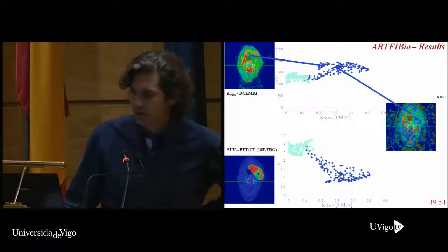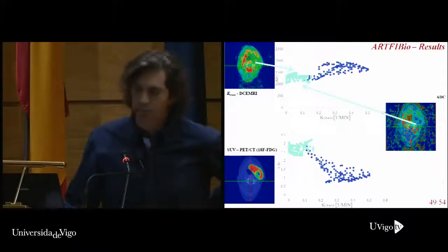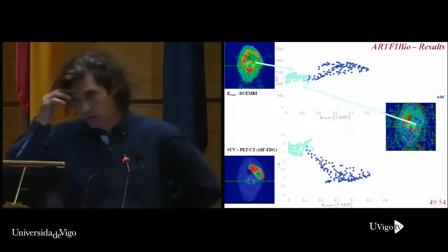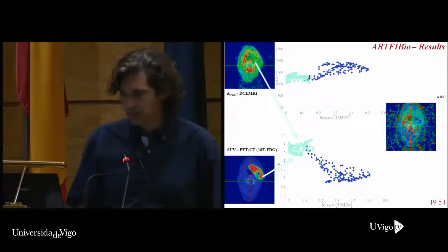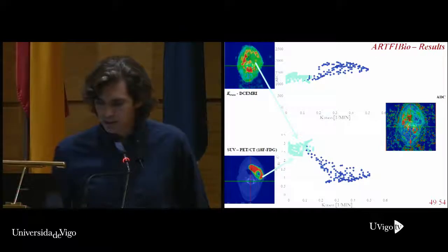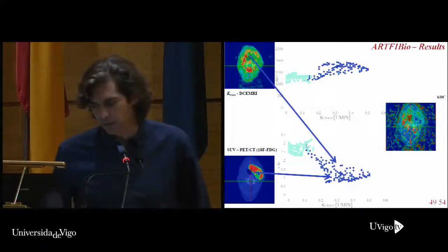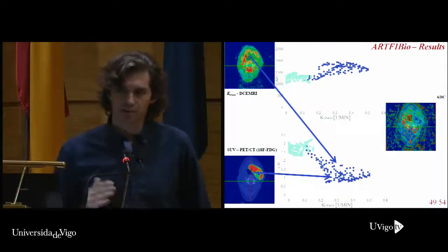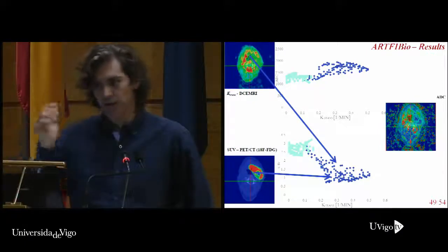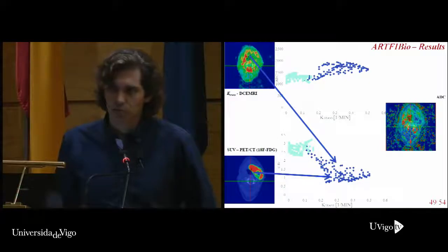And here in the well vascularized area, we cannot see a clear relationship between K-trans and ADC map. Less ADC means more tumor cell density, more ADC means less tumor cell density. Here we cannot see a clear relationship, but in the hypoxic area, when we compare the K-trans with the standard uptake value in PET-CT, we can see a high value of standard uptake value. In the region where the vascularization varies, we can see a variation of the standard uptake value. It looks like the Pasteur effect is working here. It looks like K-trans is a good marker of hypoxia.